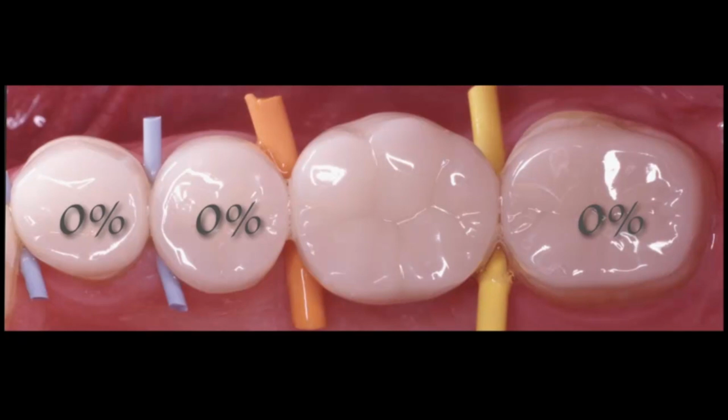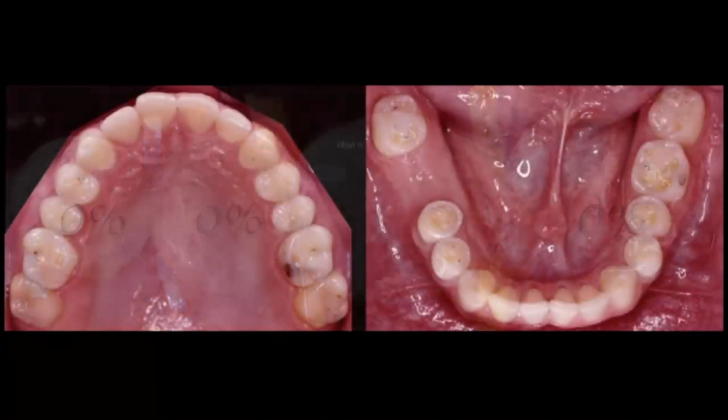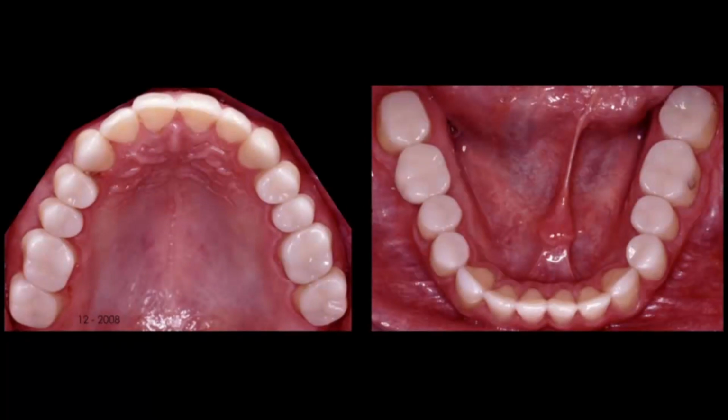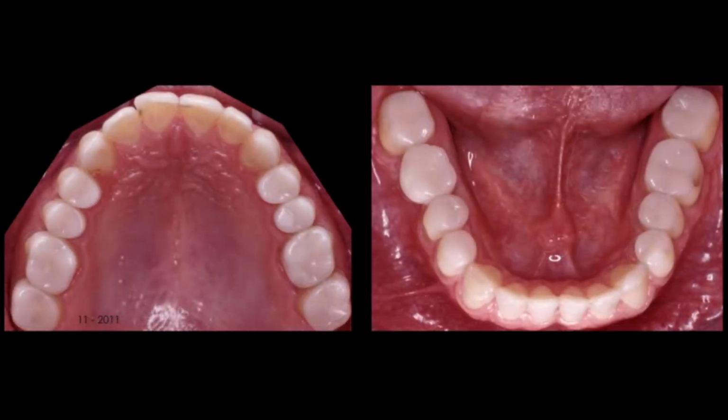So we did so, and please note those are single tooth restorations bonded to the dentition, which was worn by mechanical and erosional reasons. So you see the case that was 2008. The patient did not appear for 3 years, and he came back to our practice in the year 2011, and you see what happened. What happened? Look at the details. A lot of wear all over.